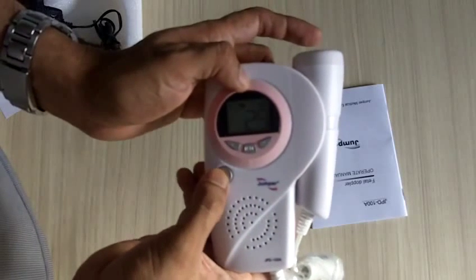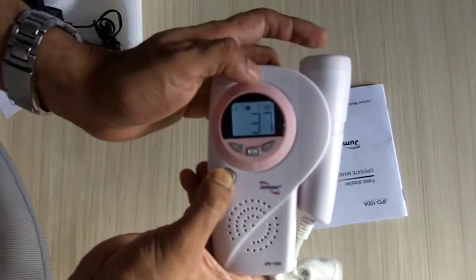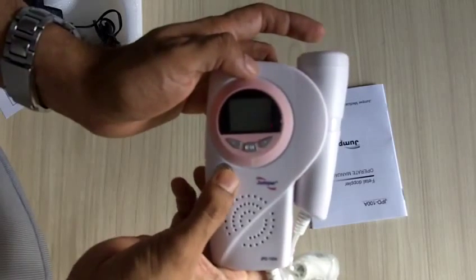During that time, if you press this button you can reduce the volume as well. To turn off the machine, press the on/off button again for about two seconds, which will turn off the machine.